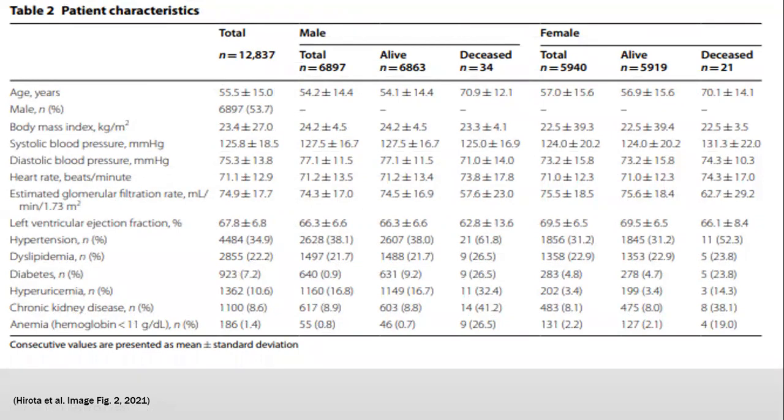So they weren't really surprised by their findings. The high predictive capabilities of this model were due to having a large number of ECG parameters and this application of machine learning. They feel that they proved that the ECG readings can be used as an additional predictor for mortality in patients.